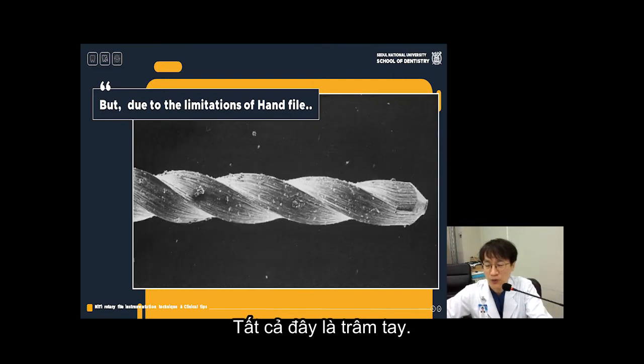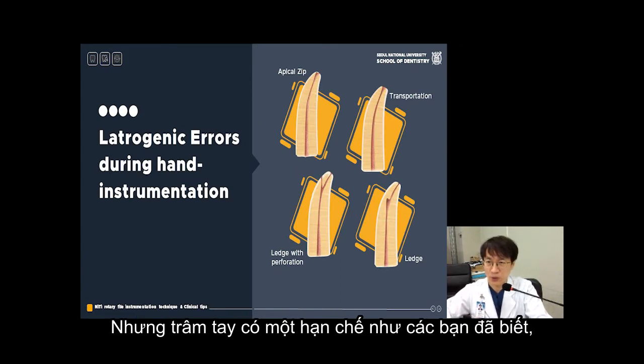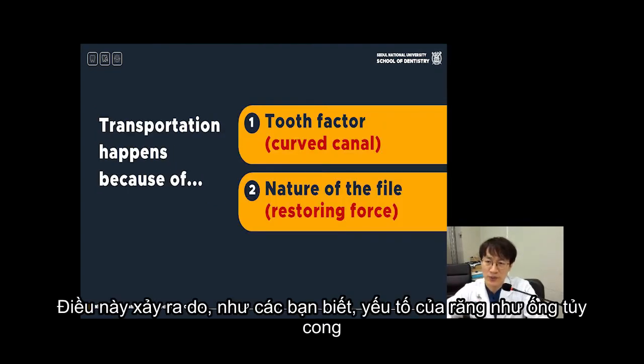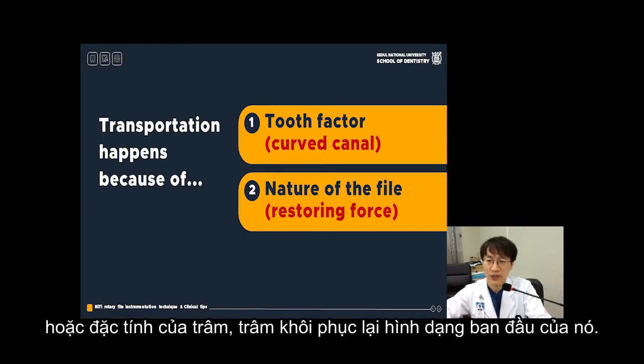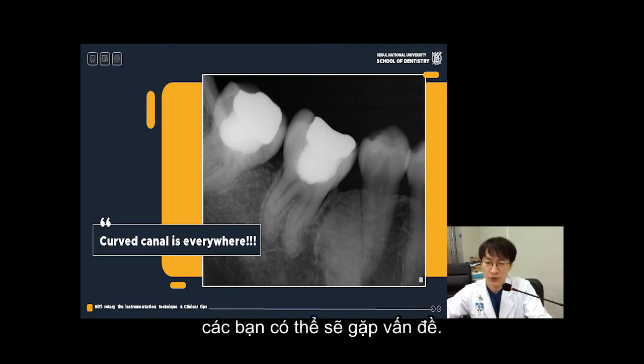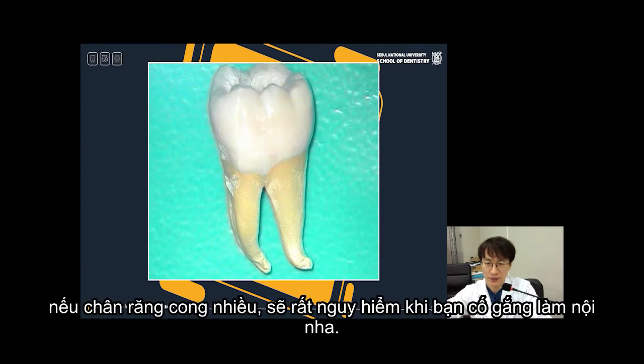So these all came from the hand file, but the hand file has a limitation. As you already know, there are lots of iatrogenic errors like transportation, ledge or zip. It happens because of the tooth factor, like a curved canal, or the nature of the file. The file tends to restore its original shape. So when you use a file in a curved canal like this, you're going to have problems like this. When you extract the tooth, there is a severe curvature, so that's really dangerous when you try to do the root canal.